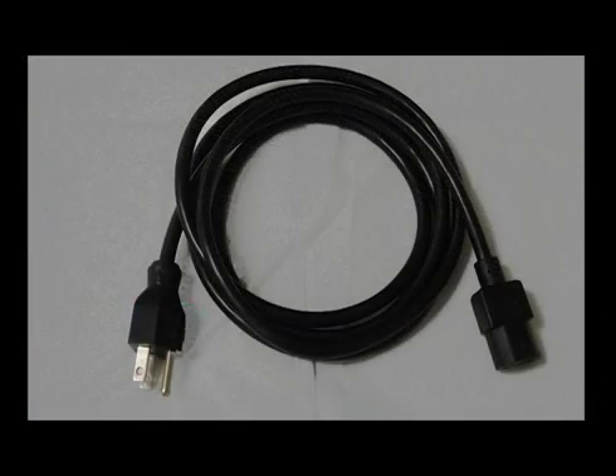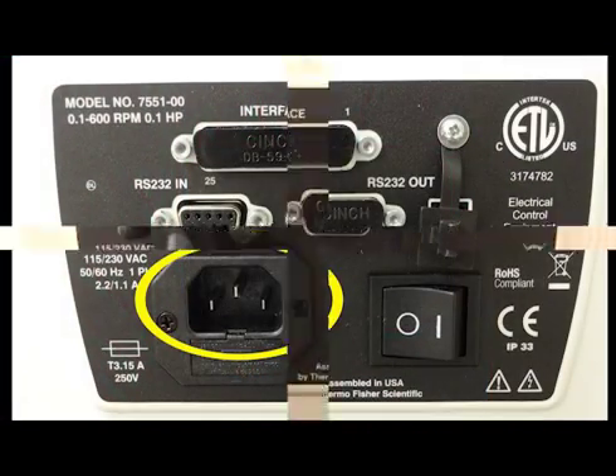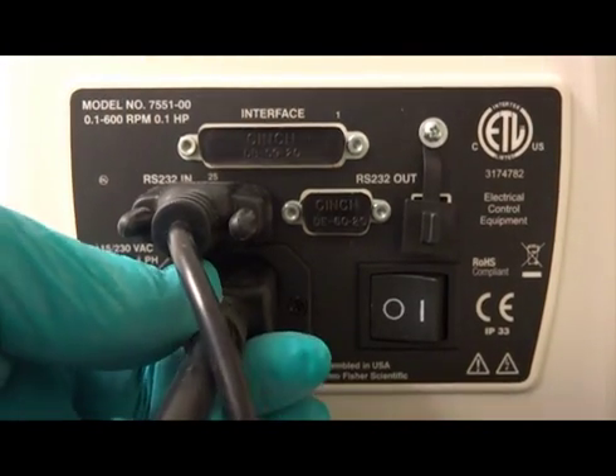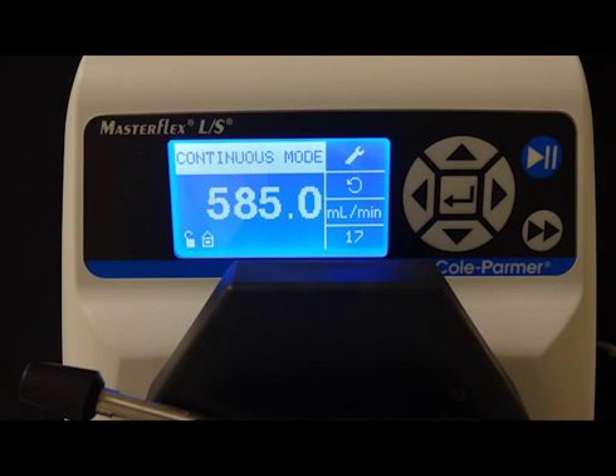Using the provided power cable, connect the female end to the outlet on the rear of the MasterFlex pump. The opposite end of the cable connects to the power outlet. Use the flip switch on the rear of the MasterFlex pump to turn the pump on. The digital display on the front of the pump will turn on.